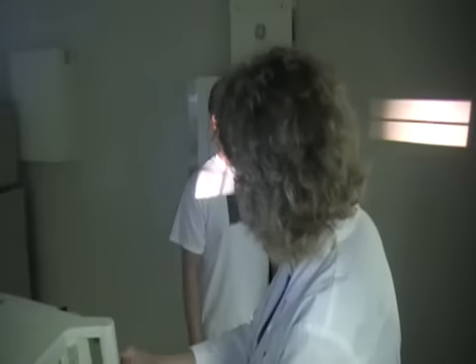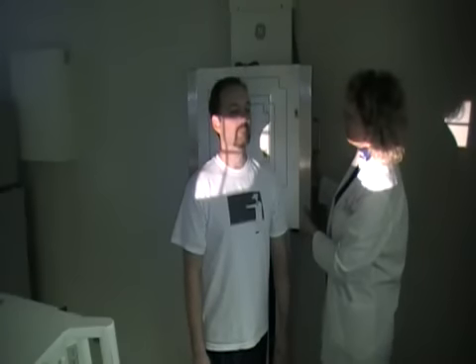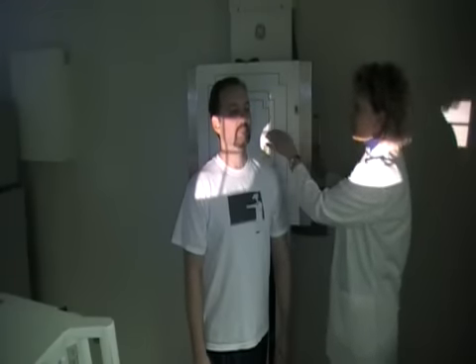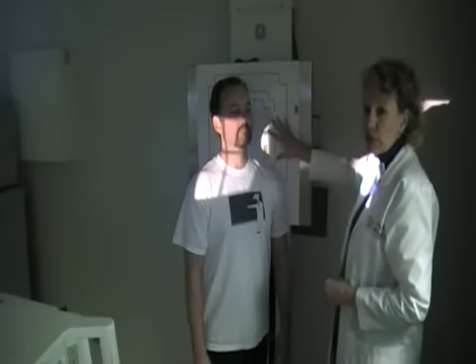Bring that down, and you want to center it at that upper level of the thyroid cartilage. David's pointing it out for you. And then adjust your Bucky tray so that it is centered with your central ray. Okay, since his left shoulder is touching, this is the left AP oblique of the cervical, and my left marker is already up there from that left lateral, so we don't have to change that.